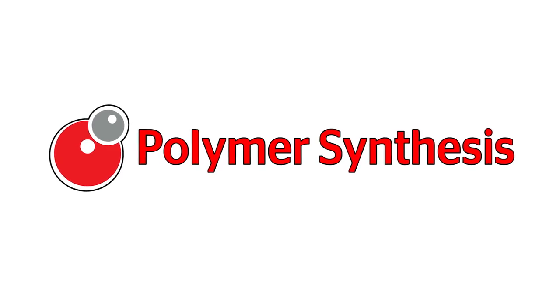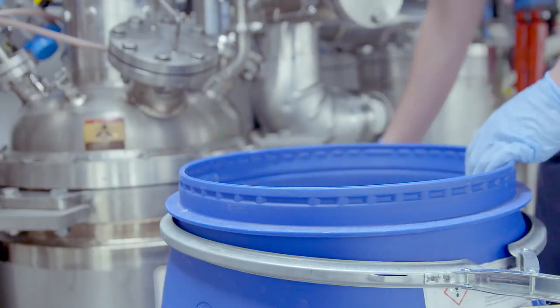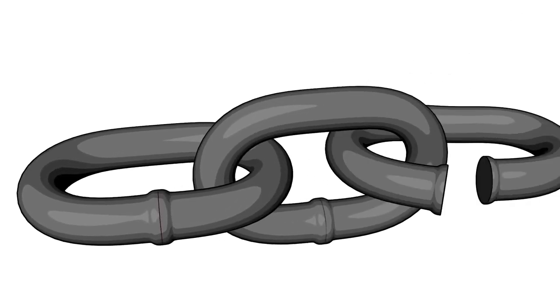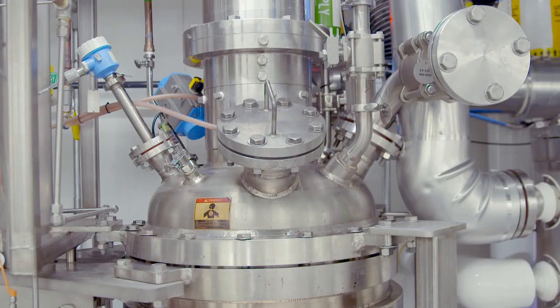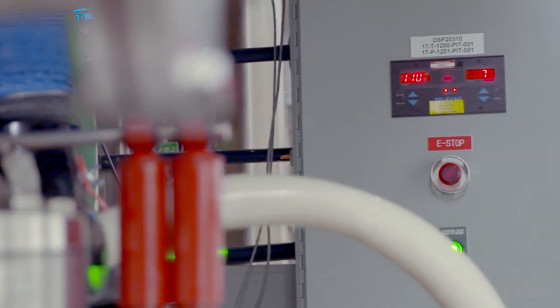The first step is polymer synthesis. This is when a monomer becomes a polymer. You can think of a monomer being like a single unit, and then you take those monomers and you polymerize them and you build them into very, very long chains. That would be the polymer. So it means many units. Ethicon works with 4 different monomers that, when heated and combined into polymers, deliver different properties.